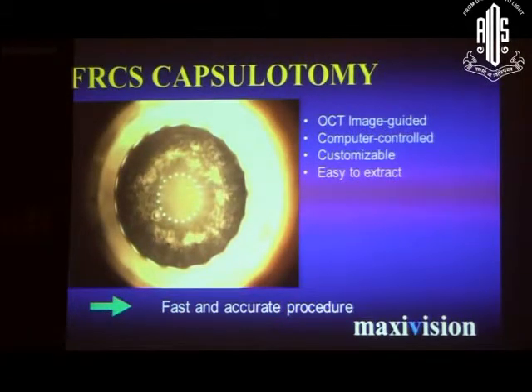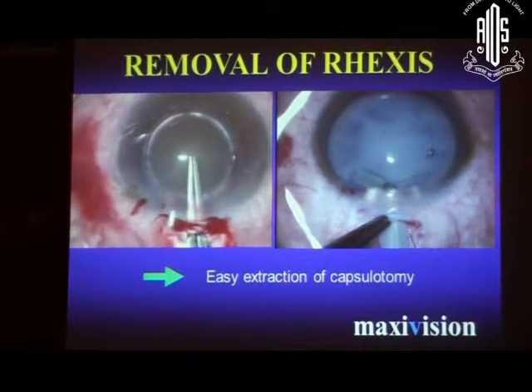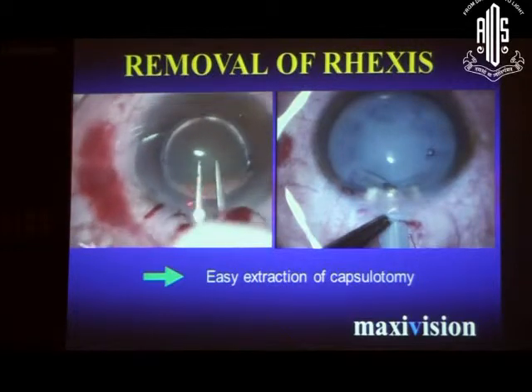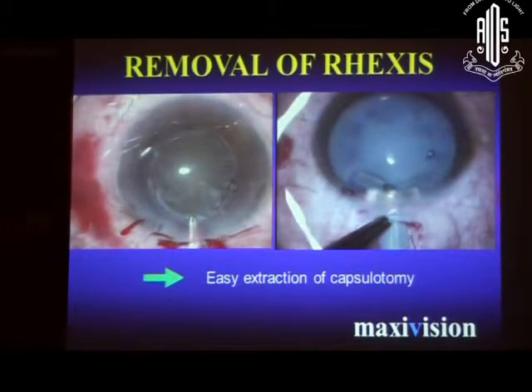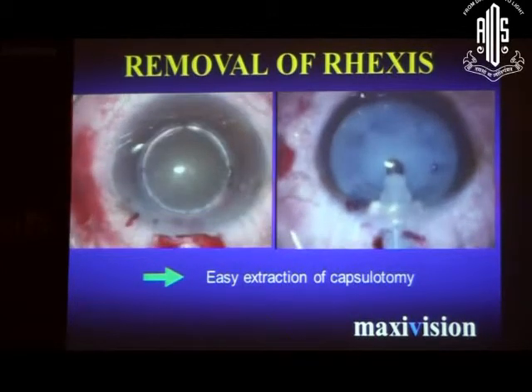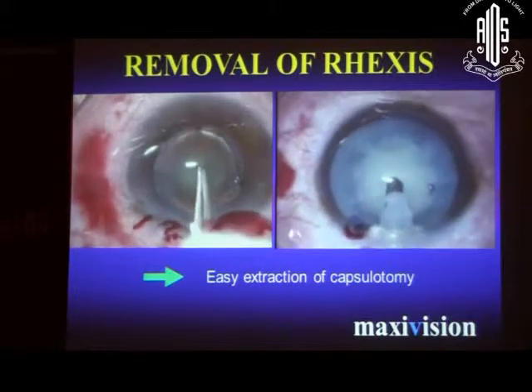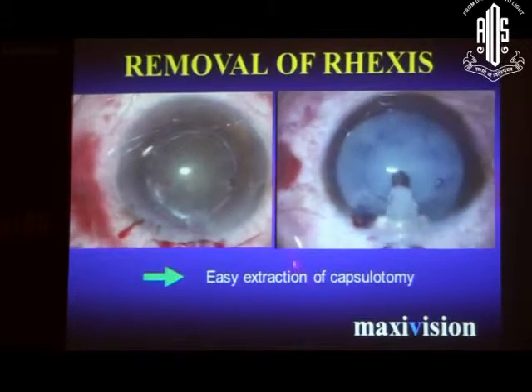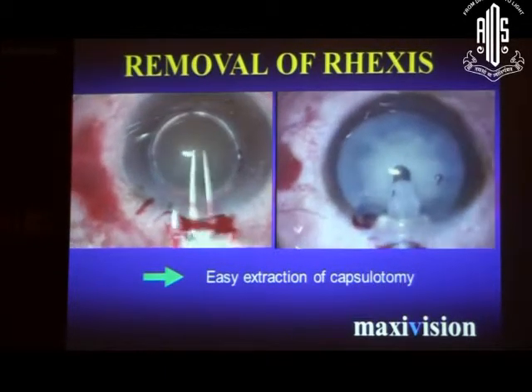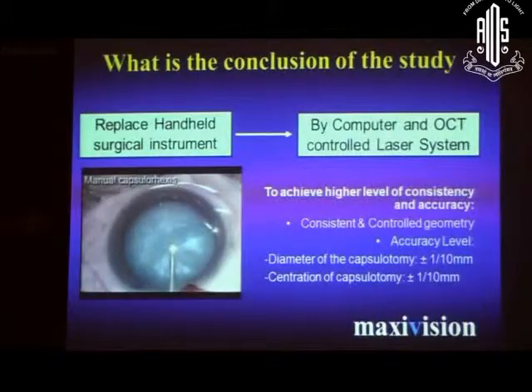You get this kind of capsulotomy, and initially I was very careful. I was using a simple Hoskins forceps to hold the capsule and gently remove it. But after 4 or 5 cases, as you can see, I don't even need to remove it; I just use the tip to aspirate the capsule and get on. A gentleman a minute ago was asking about intumescent white cataracts. We get this kind of free-floating capsulotomy, and you don't need hydrodissection nor fragmentation in intumescent white cataracts. Today we also have intumescent brown cataracts, which is a different matter.